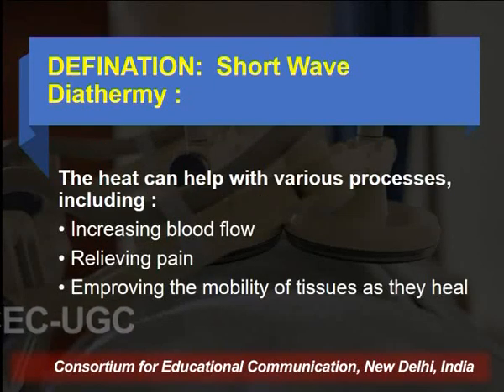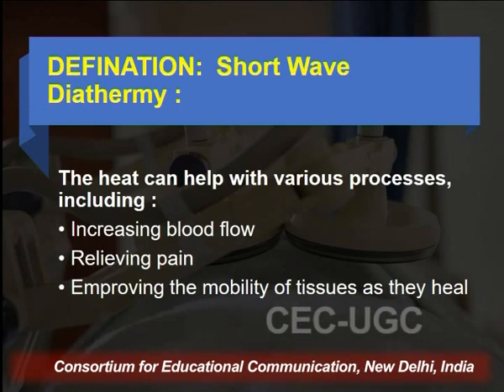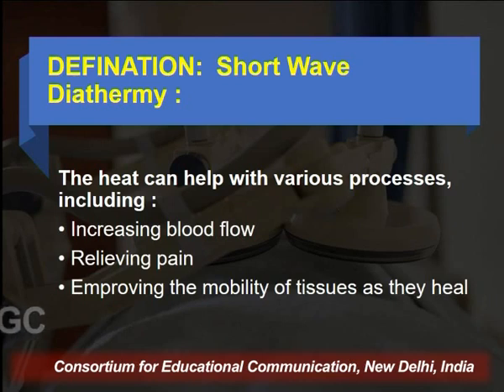So, the heat can help with various processes including increasing blood flow, relieving pain, improving the mobility of tissues as they heat or heal. So, let's discuss the types of diathermy.